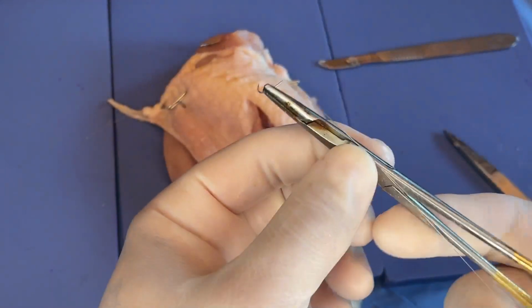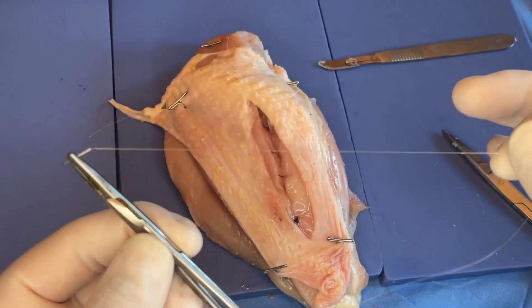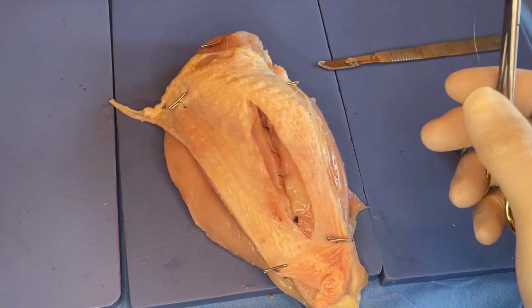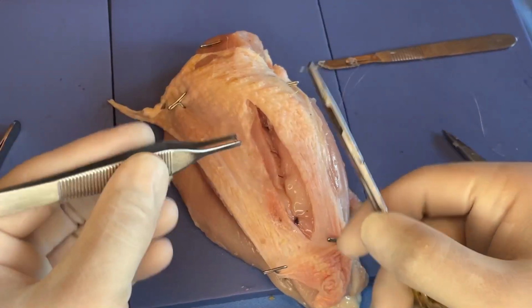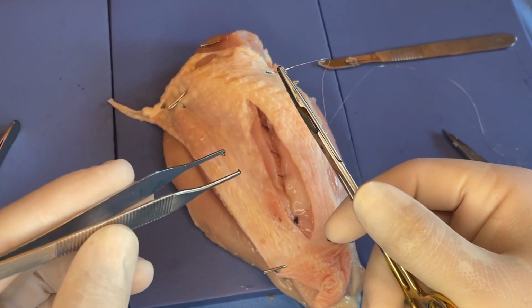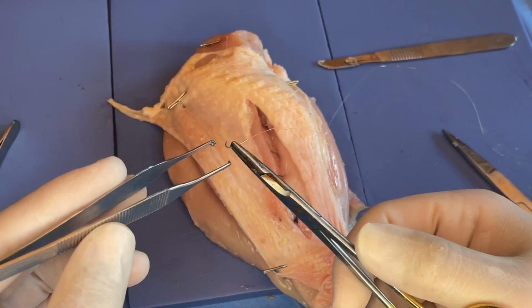So you can see with the 4-0 that is a very tiny needle, and that the suture itself is quite fine. These pickups are actually a little bit big, so I'm going to come up here, get something that's a little bit closer to my Adsons. You usually want to match the forceps to the tissue that you're closing, but also to the size of the needle.